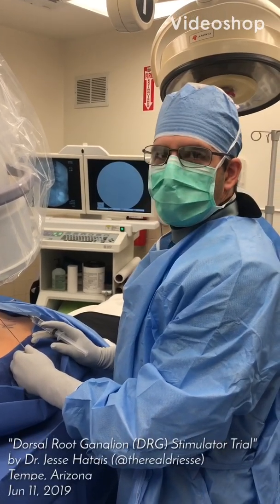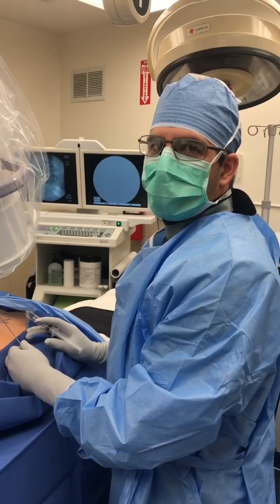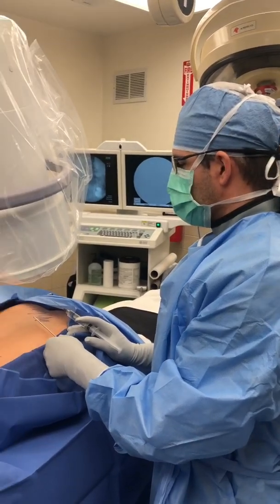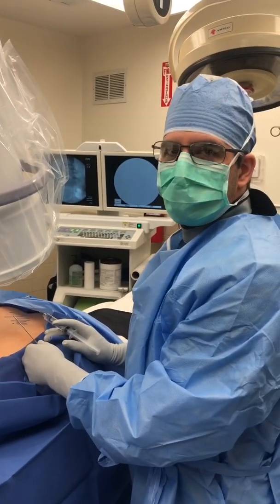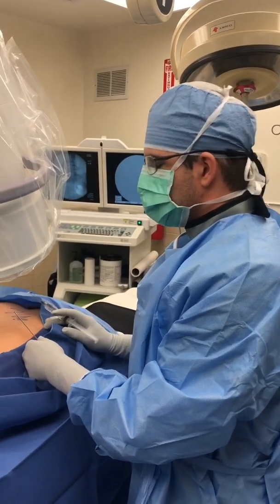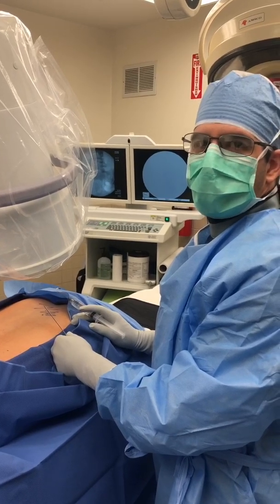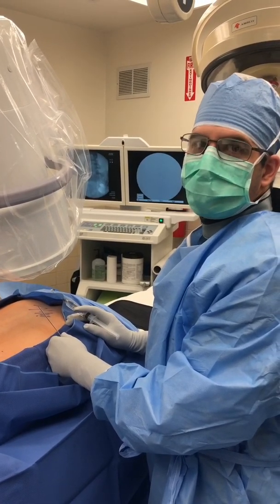Today we're going to be doing a DRG, which stands for dorsal root ganglion trial. It's a variant of spinal cord stimulation but very much geared towards a specific nerve root. In this case the patient has bilateral S1 neuropathy and we're trying to cover the soles of her feet.